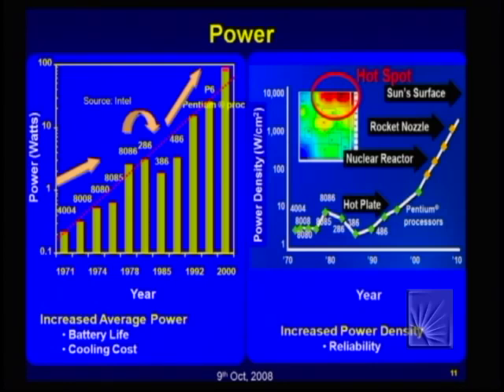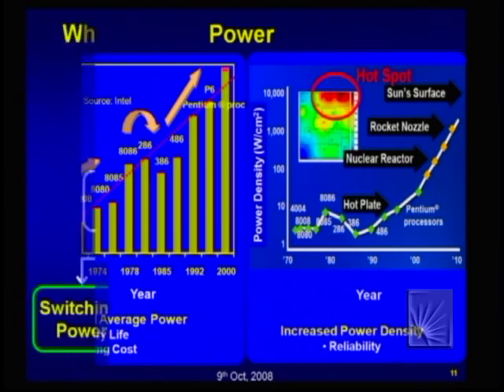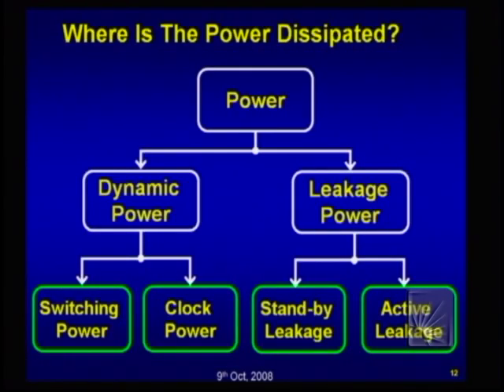So, in terms of implantable devices, power density is a major problem, because if you heat up the surface of the die, that is going to cause tissue damage. So, as a designer of implantable electronics, one needs to be careful about the power density issue, and make sure the power density is below a threshold in order to ensure no tissue damage.